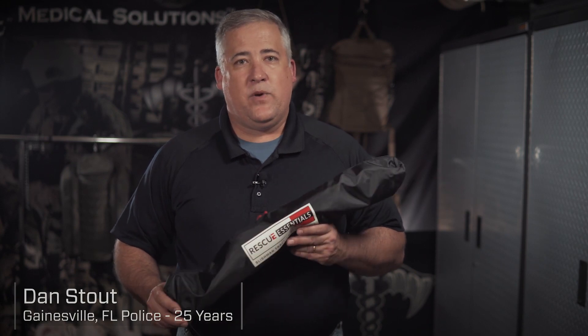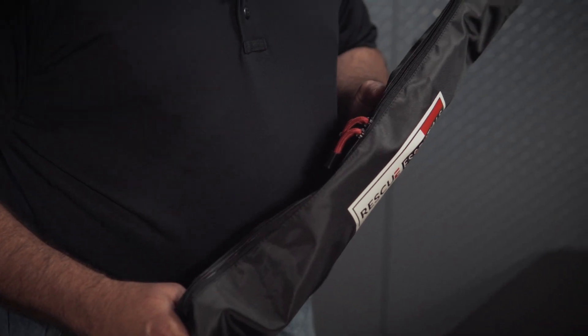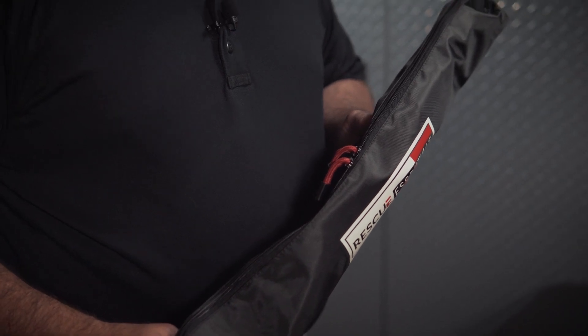Hey guys, this is Dan with Tactical Medical Solutions. I want to talk to you today about a really awesome piece of gear, the Slishman Traction Splint by Rescue Essentials.